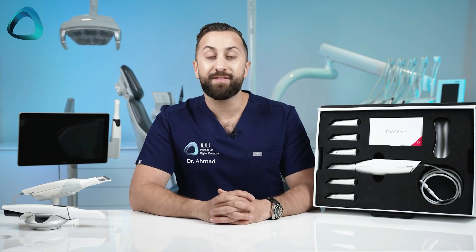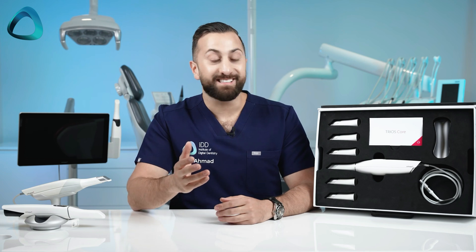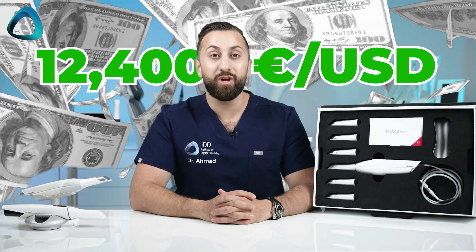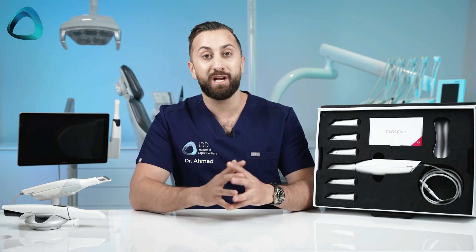3Shape scanners have some of the best brand recognition in the entire market. They are known as scanners that work very well and are considered premium. Now the company is offering a solution for those who may have been priced out by the Trios 5, Trios 4, and even Trios 3. Because for starters, this scanner costs 12,400 euro or USD — we have never seen a Trios scanner this affordable, especially on launch day.